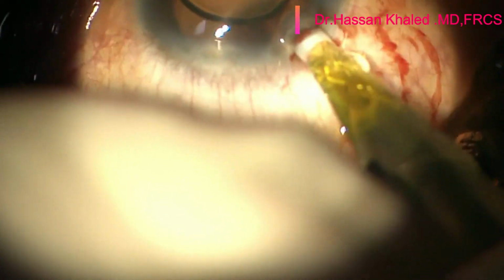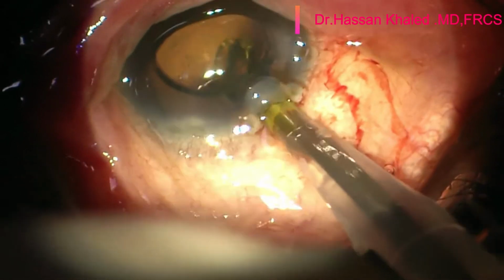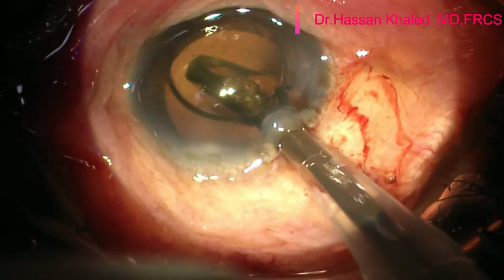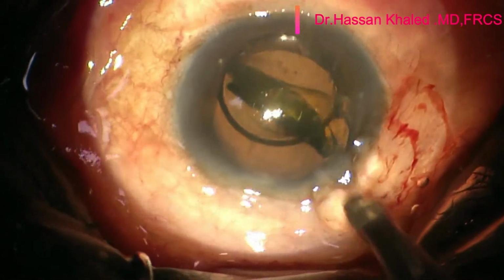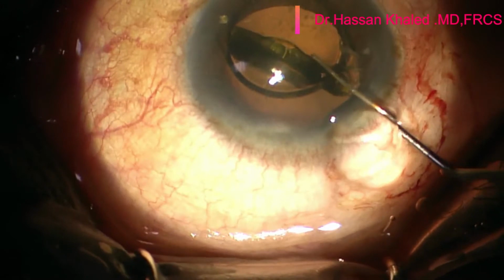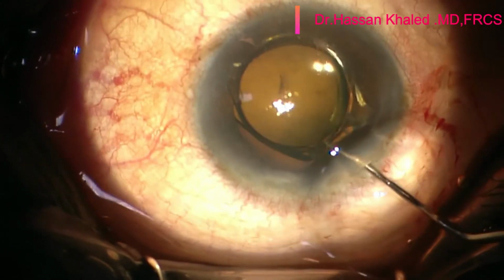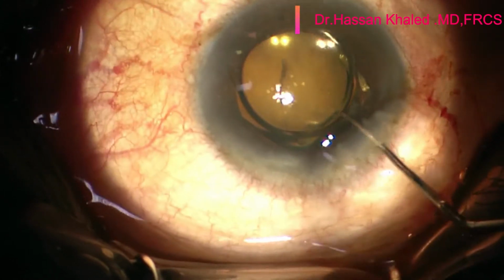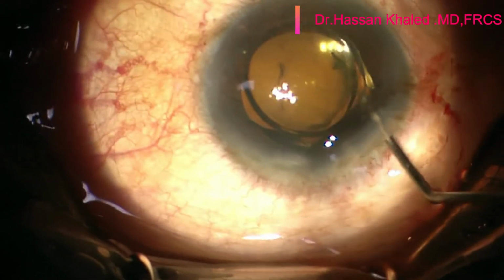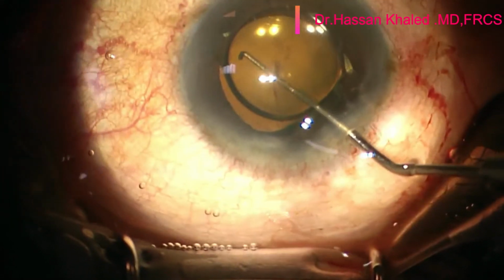Now this is the single piece hydrophobic acrylic IOL. Here the IOL is implanted into the capsular bag behind the old IOL, and the benefit of this technique, implanting the new IOL before removing the old IOL, is that the new IOL will protect the posterior capsule from any further damage during cutting the old IOL and pulling it out from the anterior chamber.